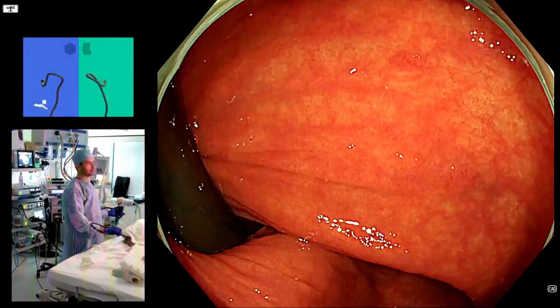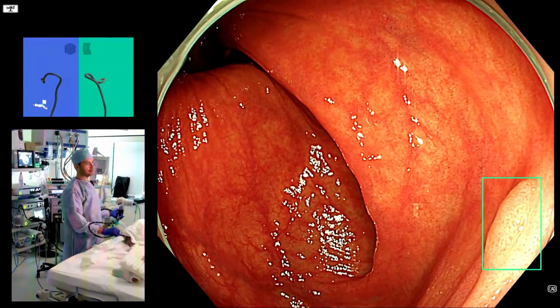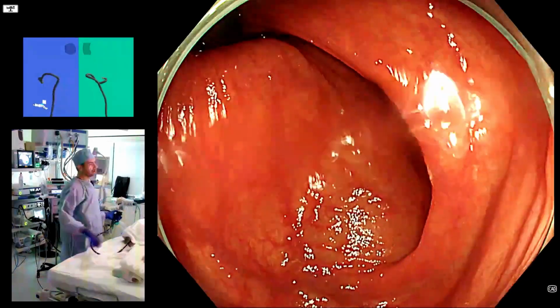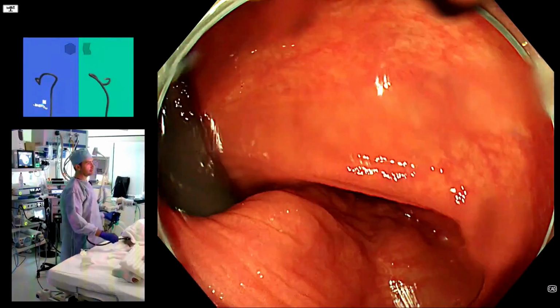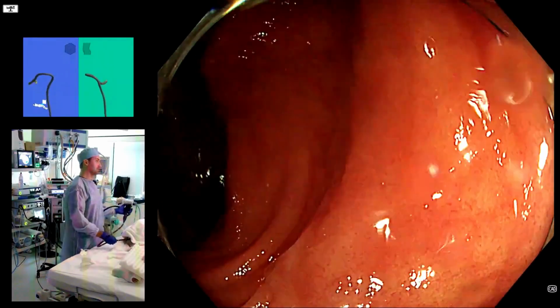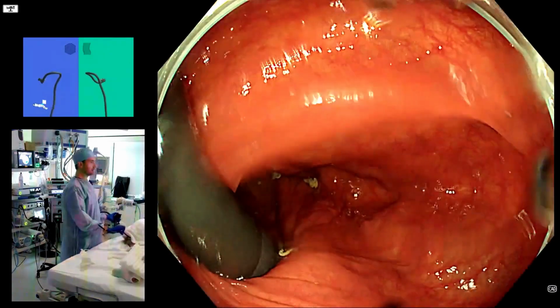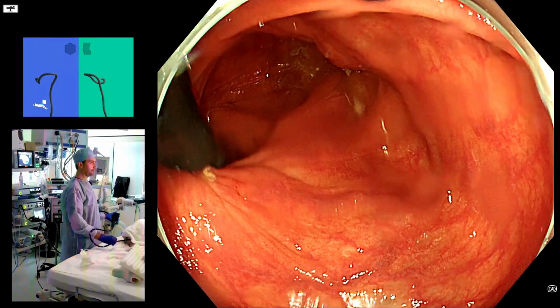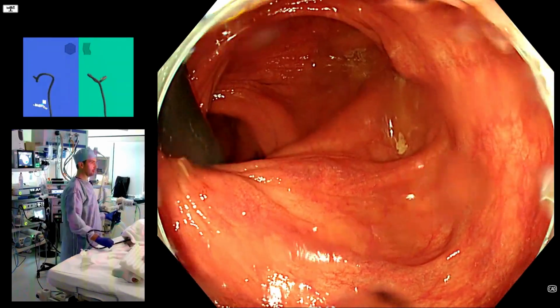So something else we didn't see, just there, sitting there, a little polyp that we would never have seen without retroflexion. So now we have to think, well, okay, but our retroflexion view is not great, so let's bring the scope more into the center of the lumen, if it's possible to do so, and distend a bit the ascending colon.